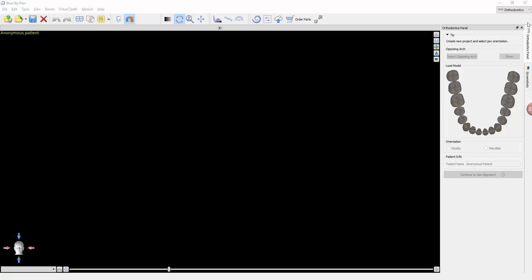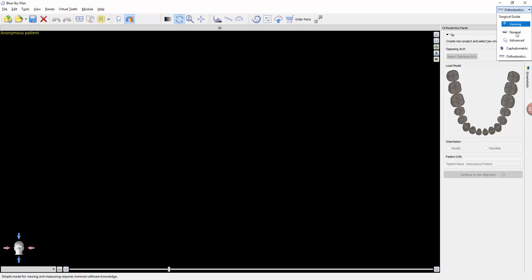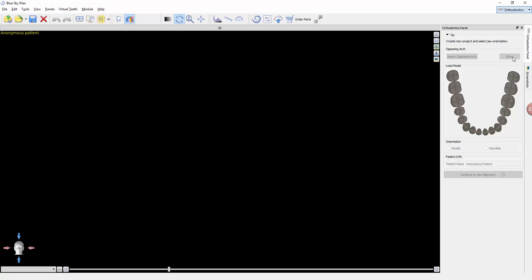First, we want to make sure we're in the orthodontic module. Over here on the top right, you can change modules from surgical guide settings to the cephalometric module, the orthodontic module, and any other modules as we add them to the software.